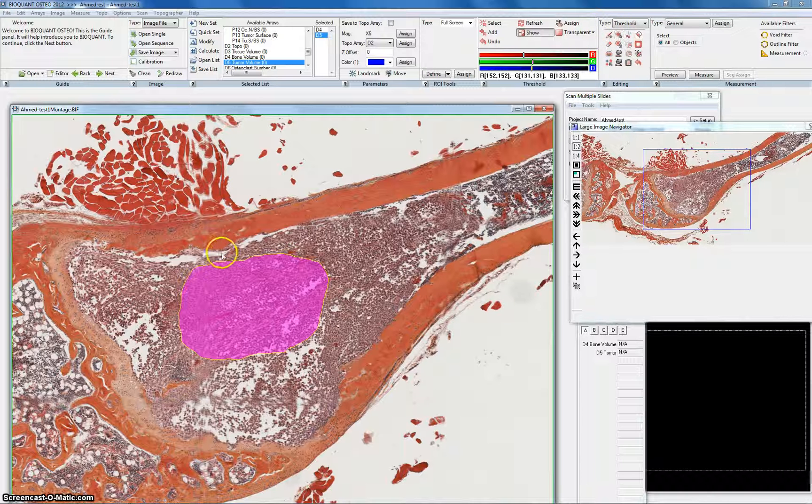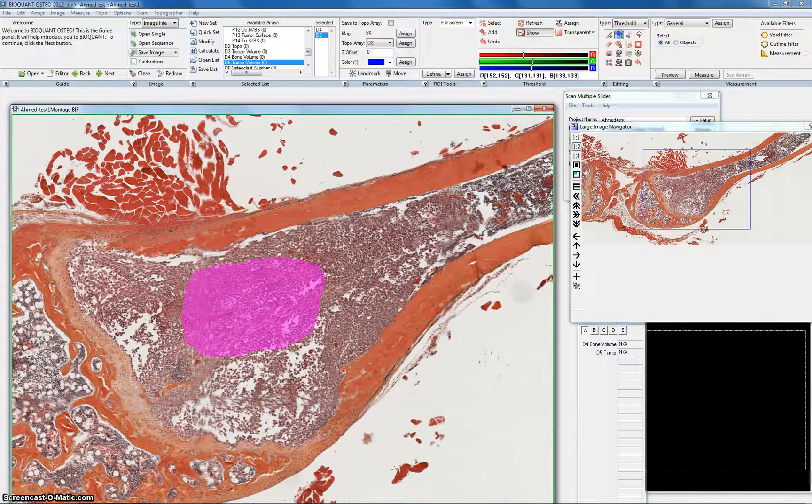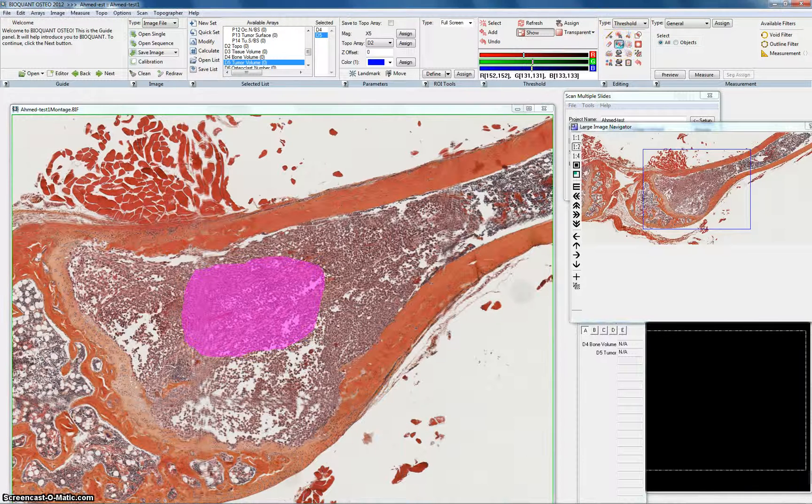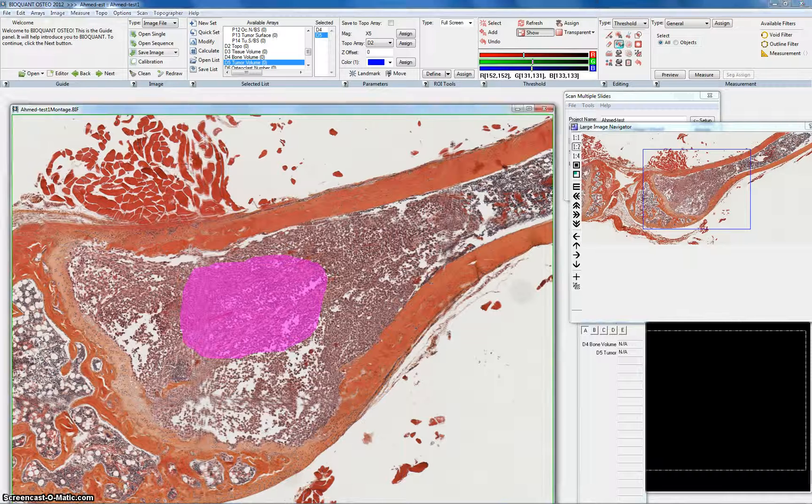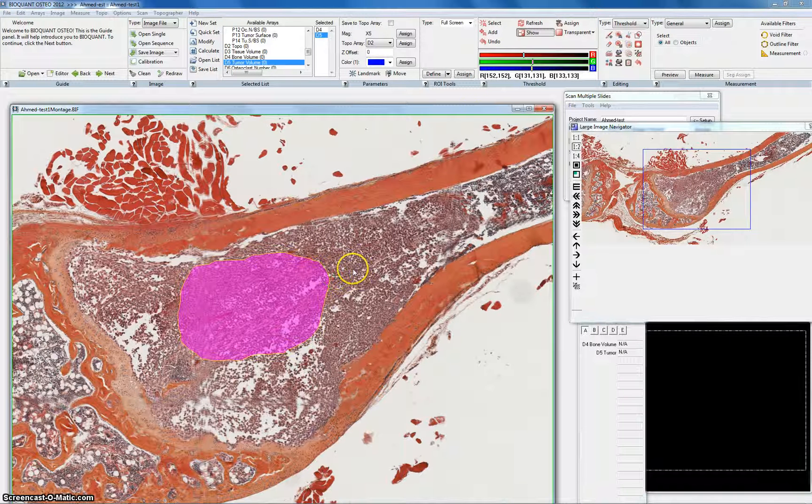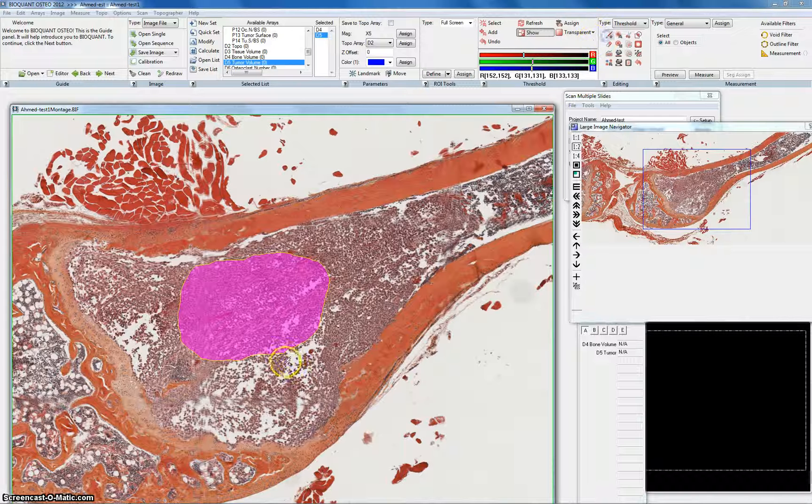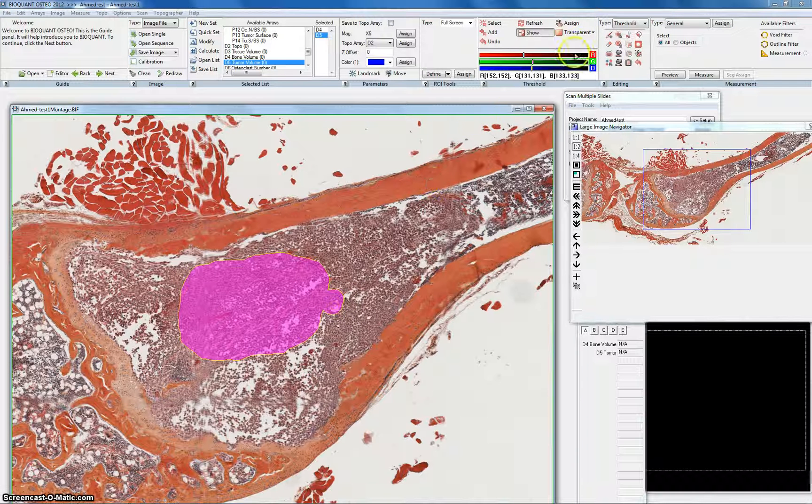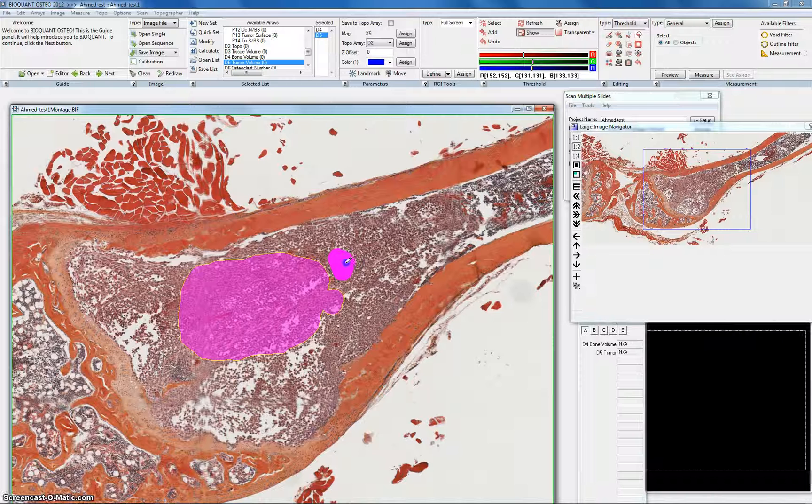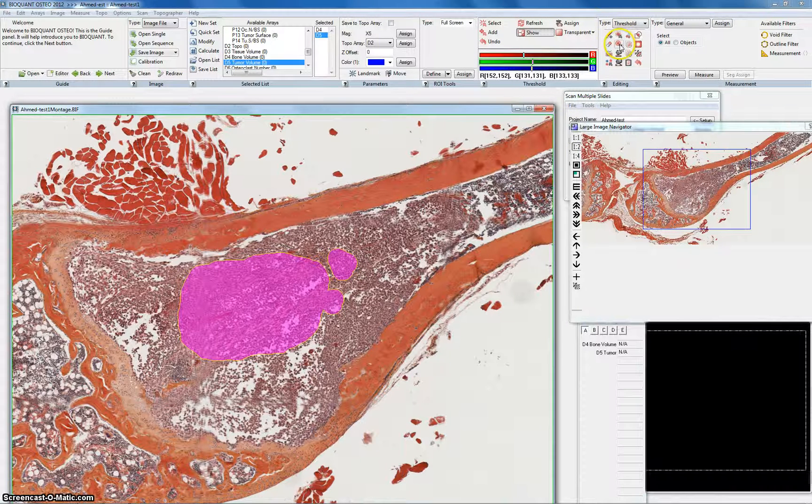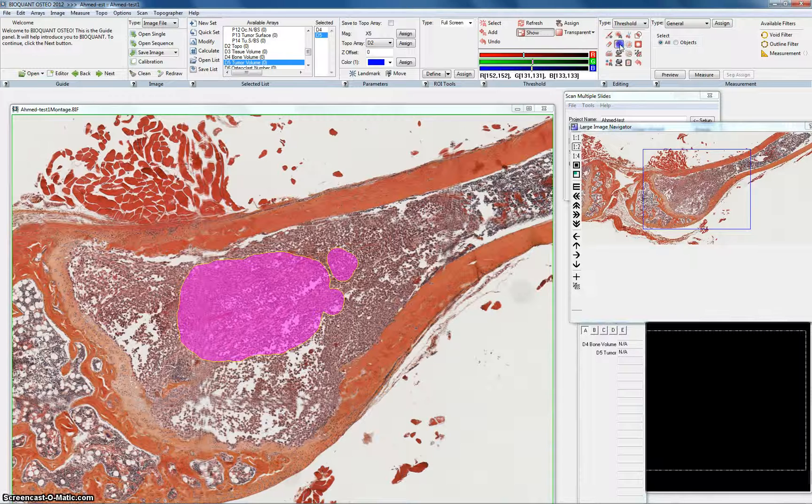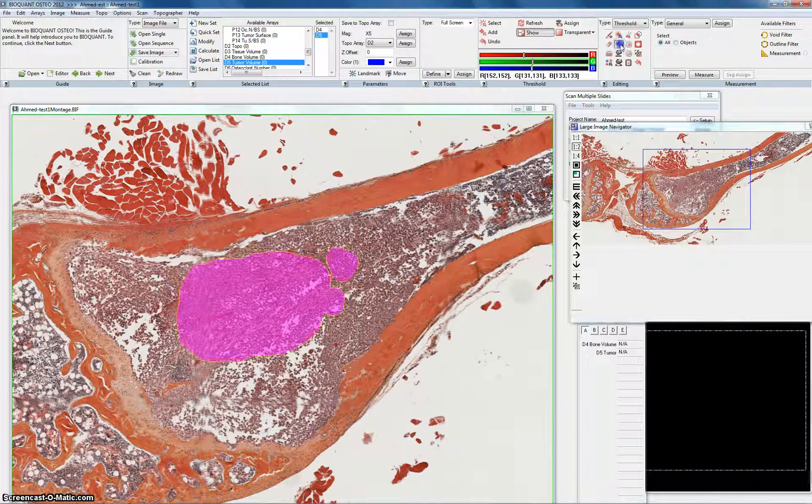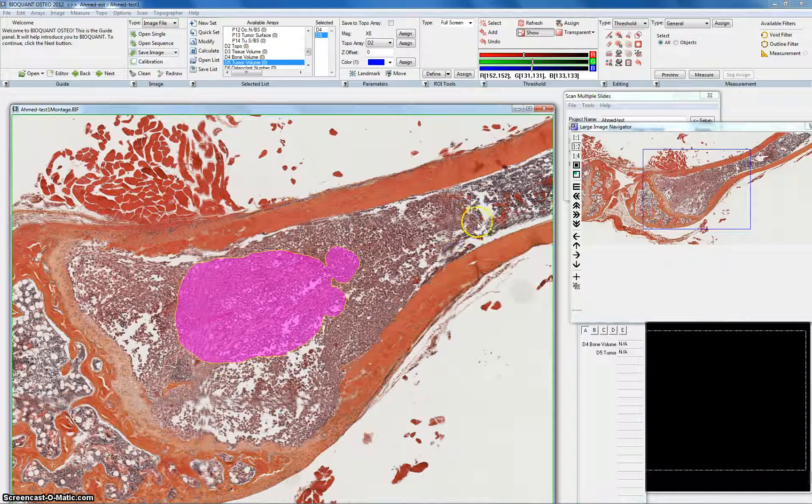This will increase like expand the borders. That one would expand. That one would shrink the lesion. It's a very minor thing. You'd feel it maybe if I hit it many more times. I can see now it's expanding back again. It will become more applicable if I did that. Let's say there's another lesion right next. Like this close. And then I keep expanding both lesions because anything expands not just one. After a certain point they will merge into one single big lesion. So careful with that.